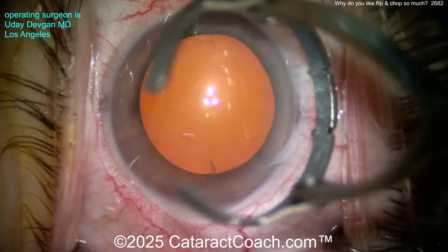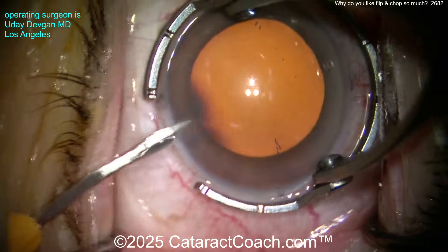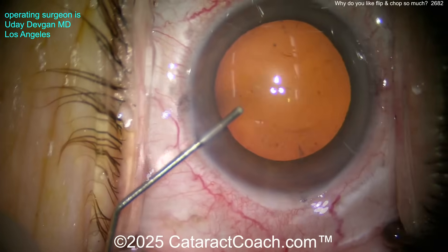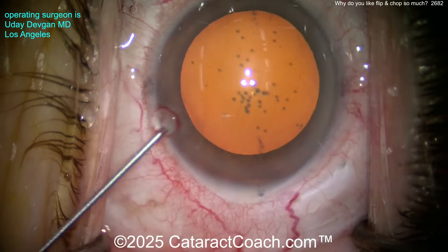This is a complete case shown start to finish. You can see there are some toric marks on the corneal epithelium — we're going to line up our toric lens with that. Here comes our paracentesis, good draping, eye in primary position. Here comes some preservative-free lidocaine with phenylephrine, and that'll help keep the pupil dilated as well as give a little bit more anesthesia.